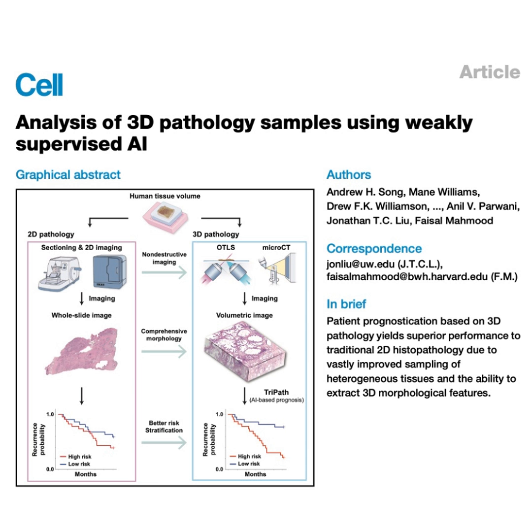You'd think so. But even with access to all that slice data, the pathologists' consensus performance only improved to an AUC of 0.799. But TriPath 3D was 0.860. Still significantly better. I'm genuinely stunned by that. Giving expert pathologists literally 100 times more image data, the full stack, and they still couldn't match the AI analyzing the volume in 3D. It really suggests something profound, doesn't it?